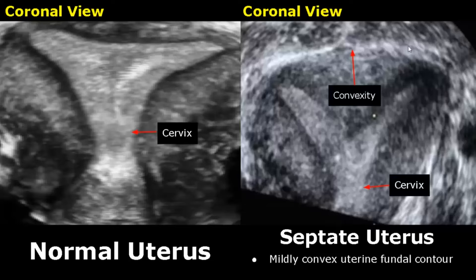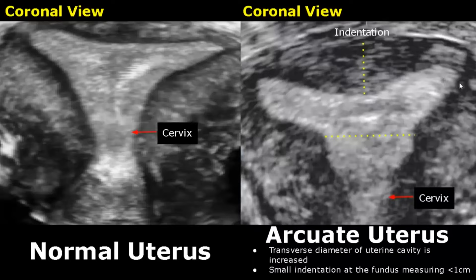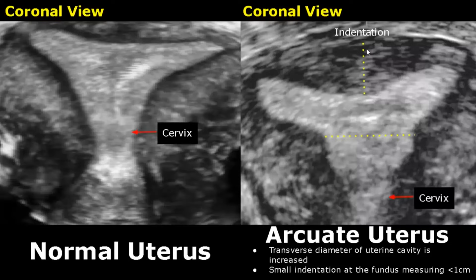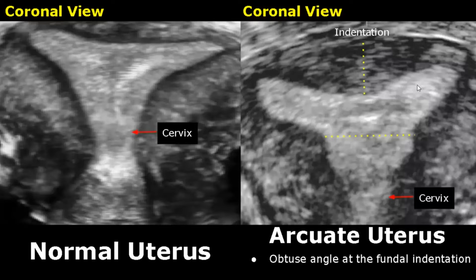The uterine fundal contour is convex-shaped, and can also be flat. An arcuate uterus is the least serious type of congenital uterine abnormality. The transverse diameter of the uterine cavity is increased, with a small indentation at the fundus measuring less than 1 centimeter. An obtuse angle is formed at the fundal indentation. An arcuate uterus is actually considered a normal variant and has very little association with reproductive failure.